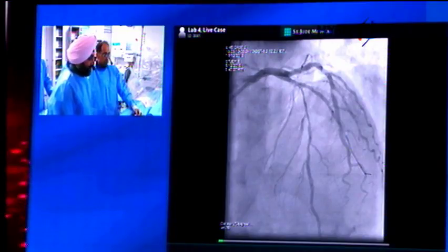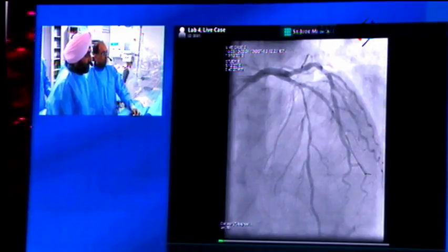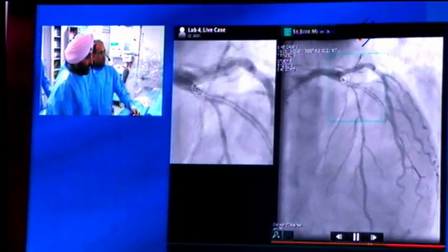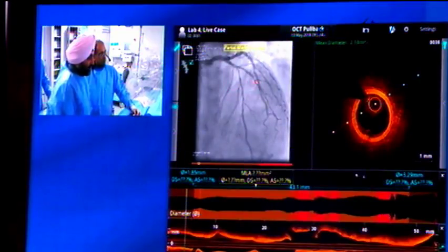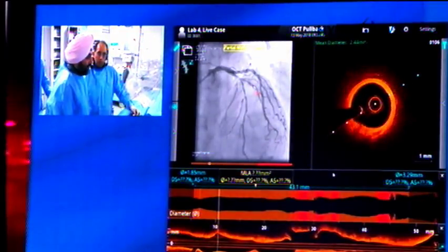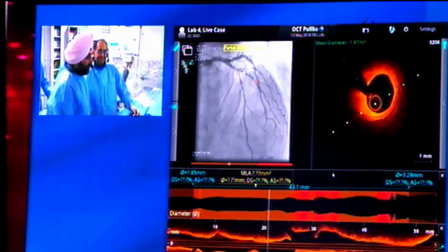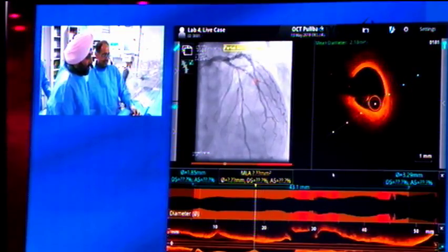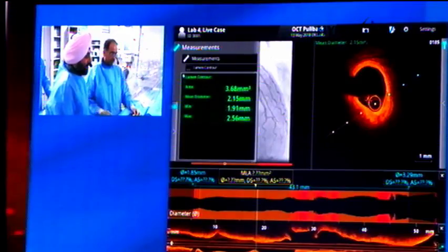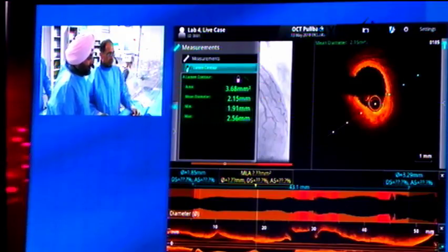We've already assessed this ourselves, but we saw there's no significant disease at the ostium. There was a proximal plaque, but we deemed that not to be flow limiting. So our decision here was that we were going to proceed with a provisional strategy, but our decision was somewhat sped up because this patient became hemodynamically unstable with ST elevation during the procedure. Typical live case. As we screen through here, we can see this is where that stenosis is in the proximal LAD. If we look at the MLA there, we can see with the lumen contours pretty much tracking the lumen accurately, the MLA there is 3.68.